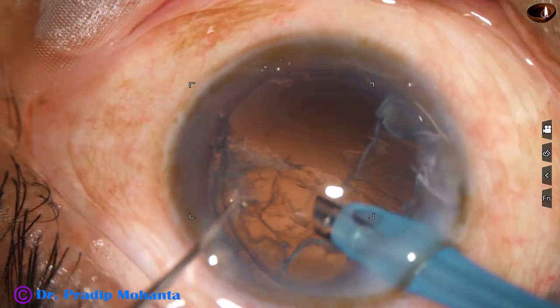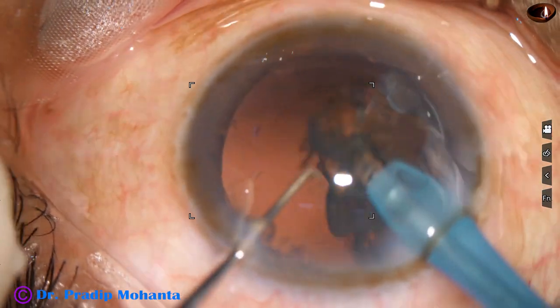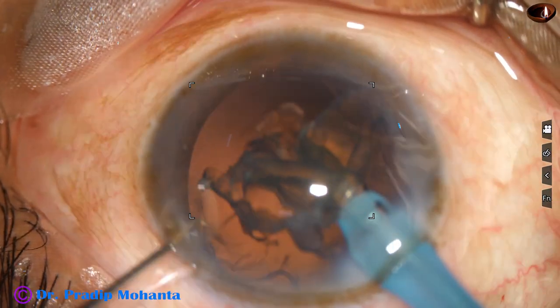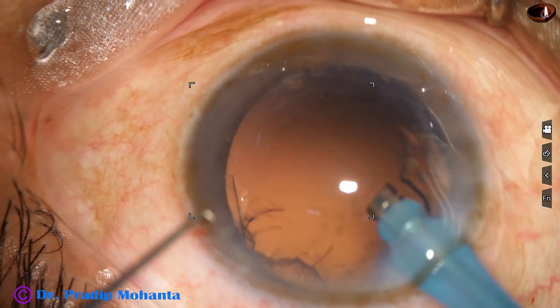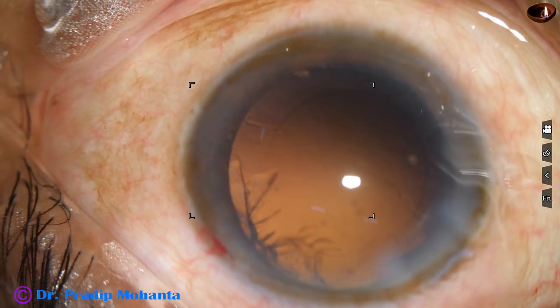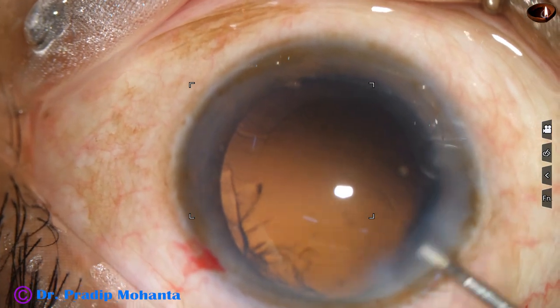Now to remove the epinucleus, I reduce the vacuum to 250 or 300 and flow rate to 30, and remove the epinucleus. Most of the cortex has also come out. Some amount of cortex remains between 12 o'clock and 3 o'clock.